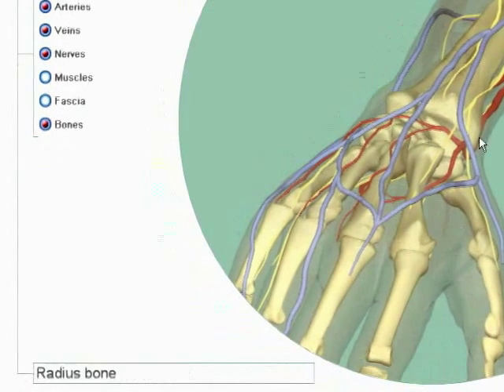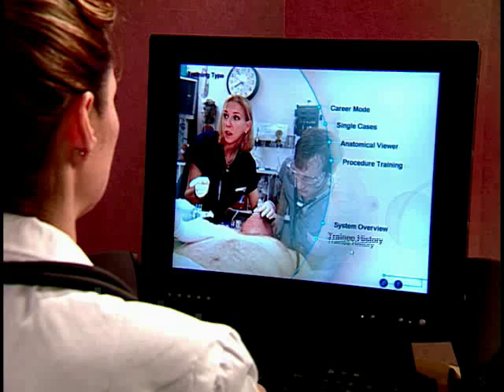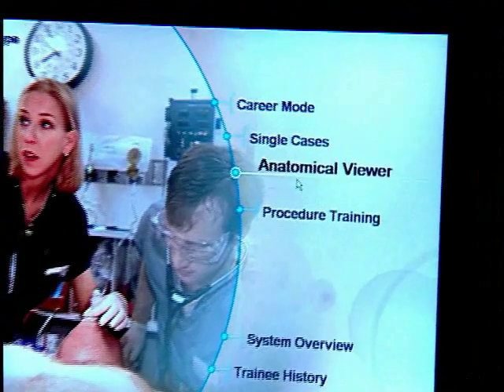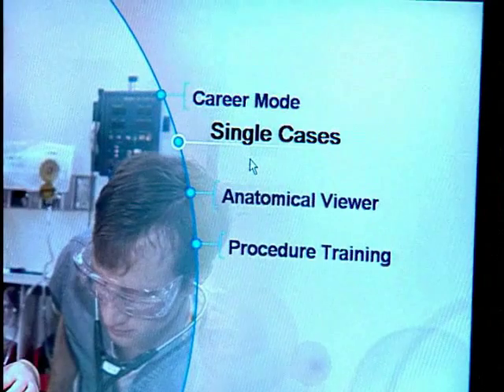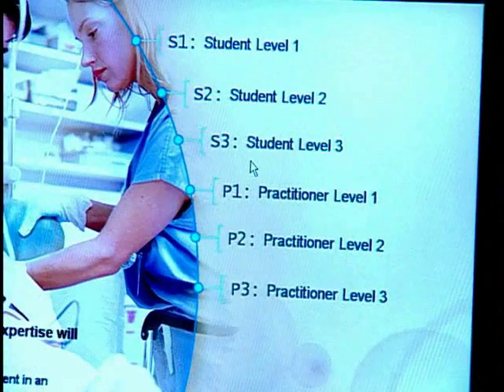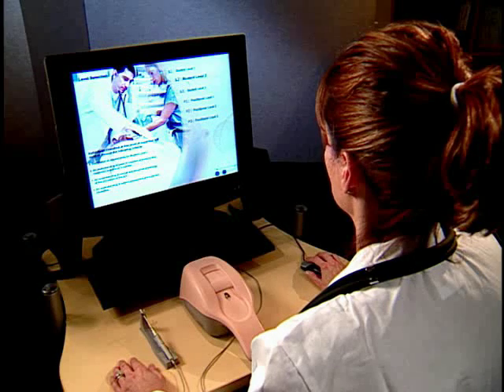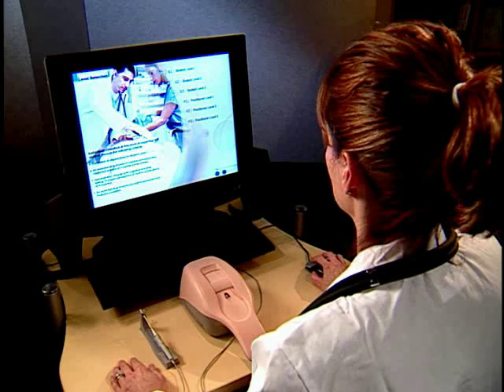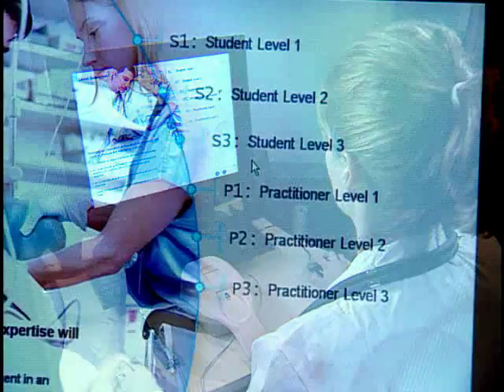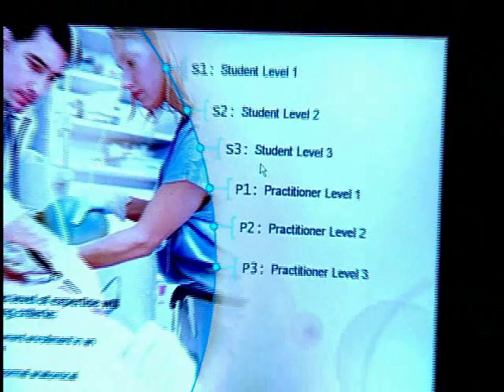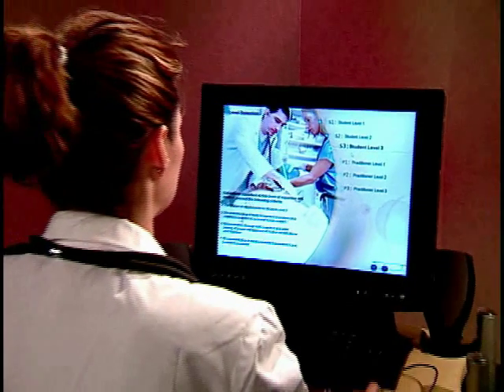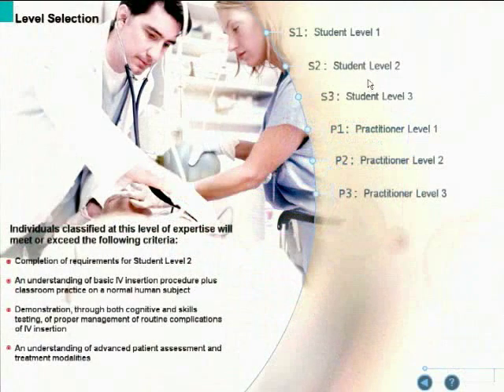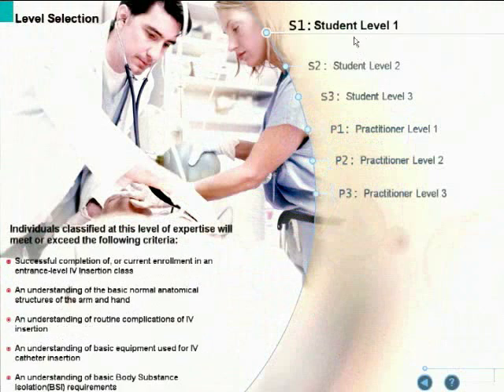If you wish to practice individual cases, click on single cases from the training type screen. Your performance on the single cases is not saved and will not appear in your trainee history. In single case mode, you can attempt cases at any skill level; each level has specific criteria and requirements for competency.